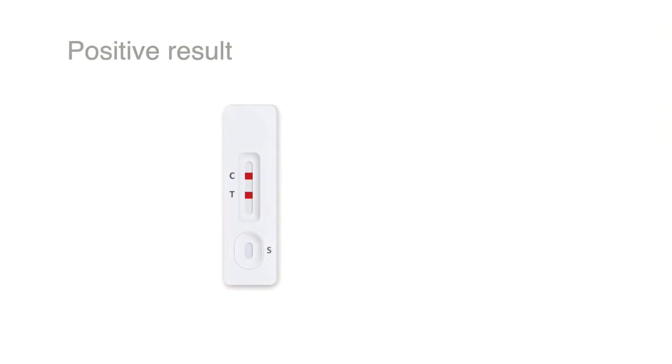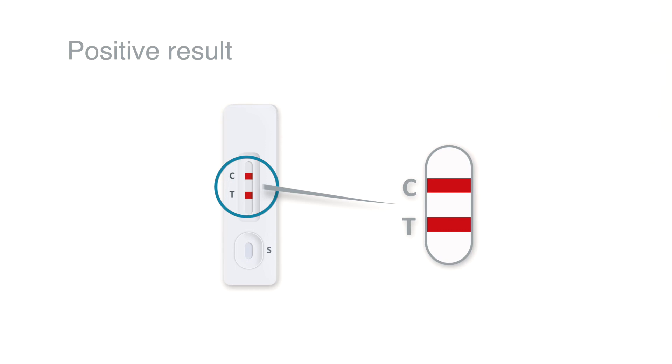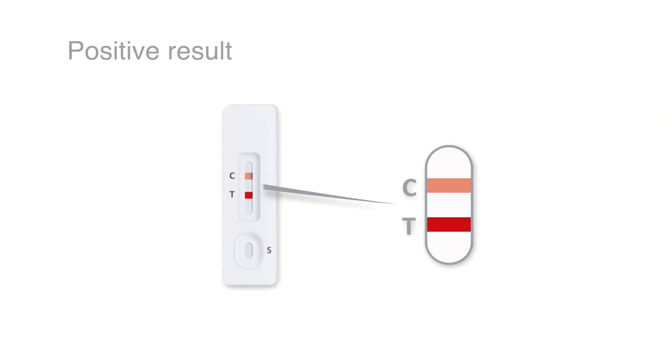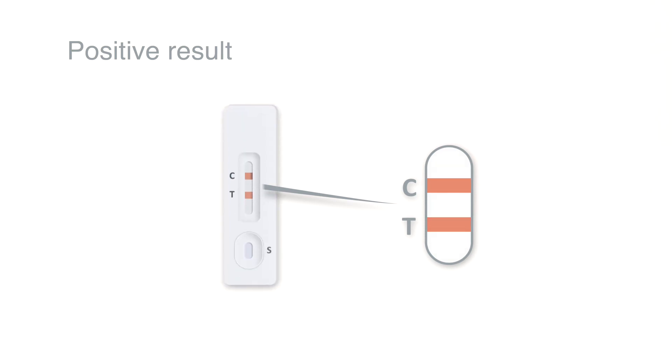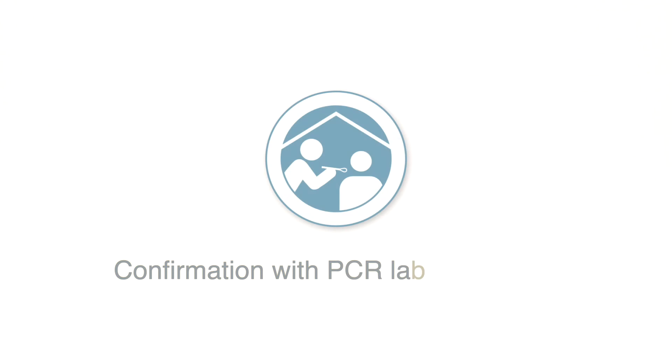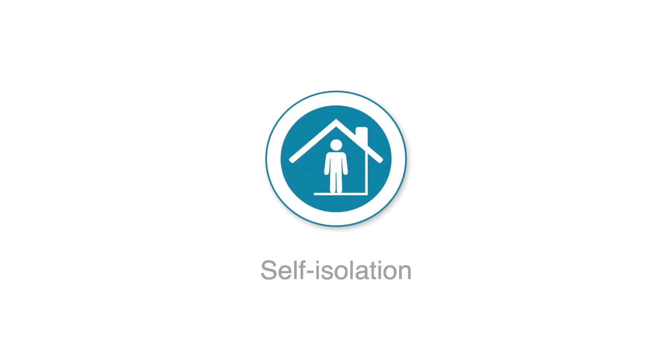The test result is positive if two lines are visible, a T-line as well as a C-line. This indicates an infection with SARS-CoV-2. The intensity of the T- or C-lines can vary. Even a weak T- or C-line indicates a positive result. In the event of a positive result, call your GP or local health centre immediately. The results must be confirmed using a PCR test. Comply with the local guidelines regarding self-isolation.